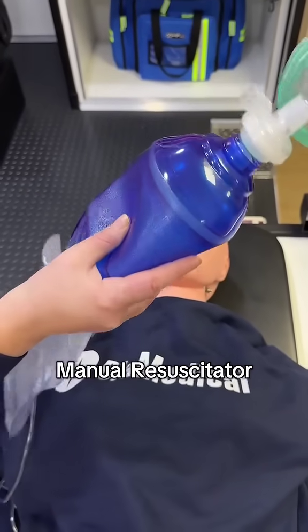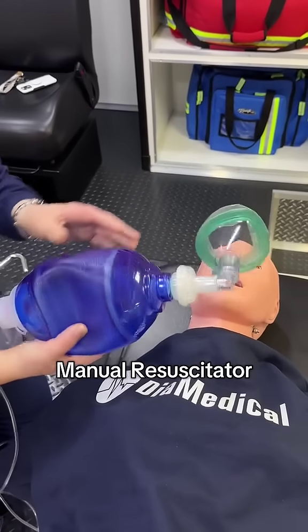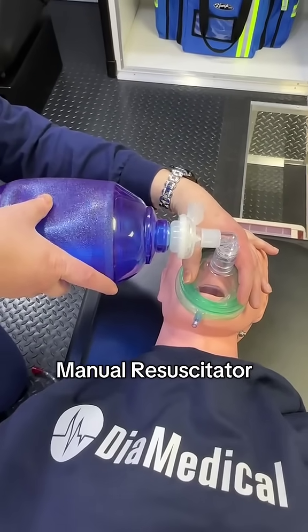Finally, the manual resuscitator, or bag valve mask. This device might have a reservoir bag on the end, but you do not need to pre-fill it. This is used in emergencies — you're going to hold this device and manually squeeze the bag to push air into your patient's lungs.